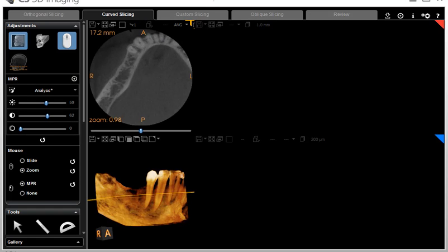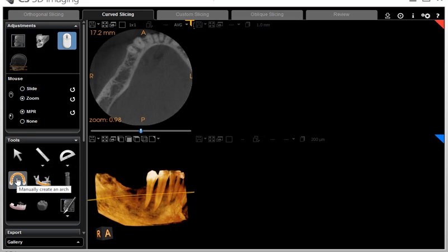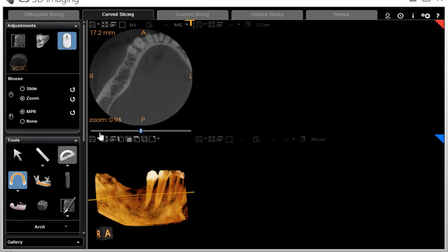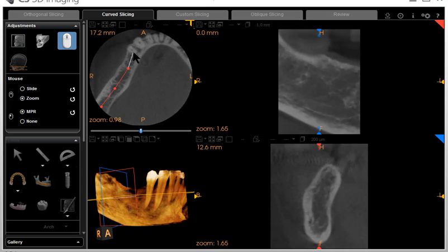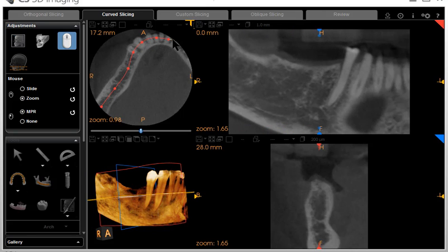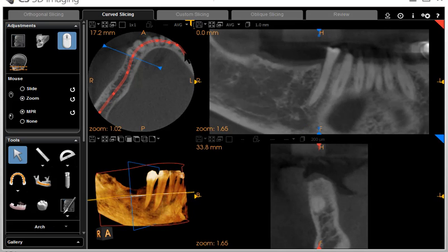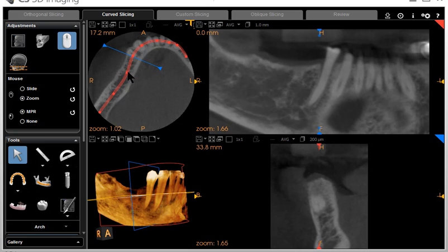Next is to go to the curve slicing. Right now there is not a curve, so we need to create a curve. This is the create-a-curve, manually create a curve. You go left-click, left-click, left-click — this is where you want the curve to be. When you finish, you do the double left-click. Now we have a pseudo pan. You can move these dots around a little bit to put the curve where it actually is.